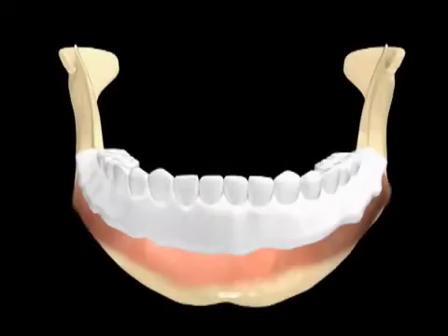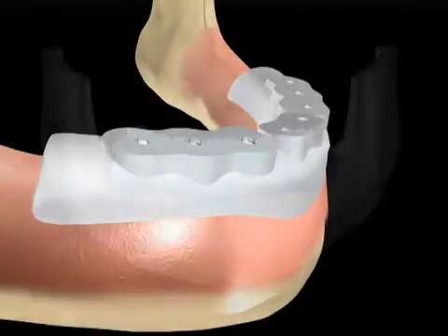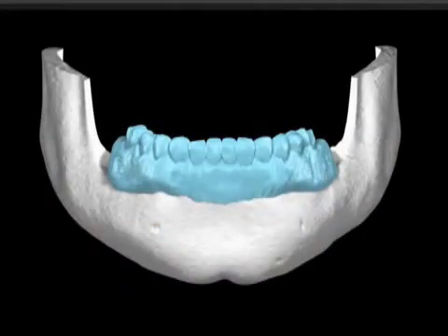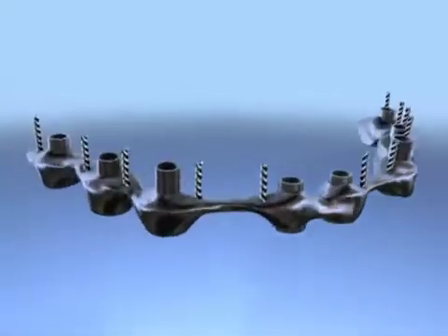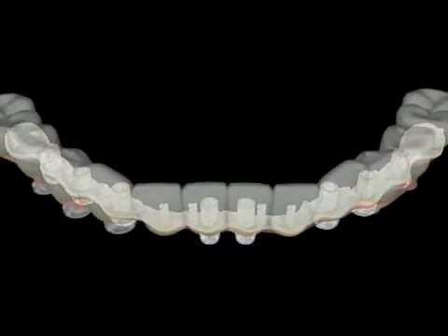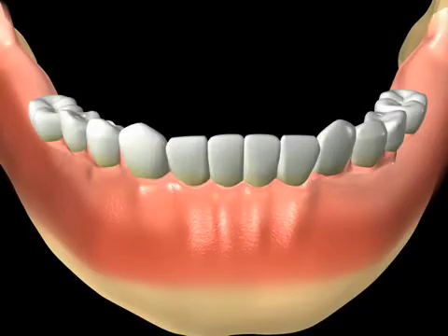In addition to routine examination protocols, a diagnostic wax up, a scanogram, scanographic guide, surgical stent, and a template for the final restorations are generated. A screw retained metal framework is the foundation for the final restoration. The functional and cosmetic components consist of composite teeth and any additions necessary to compensate for soft tissue defects. Upon placement, the prosthesis is immediately loaded.